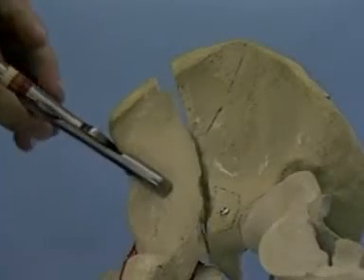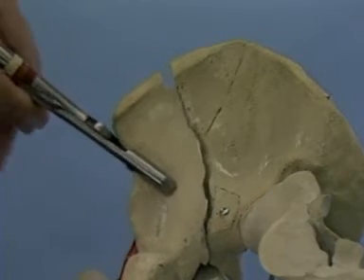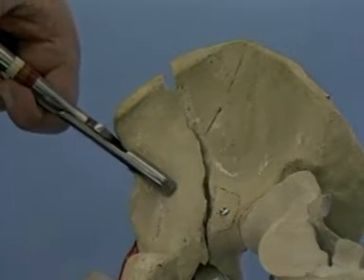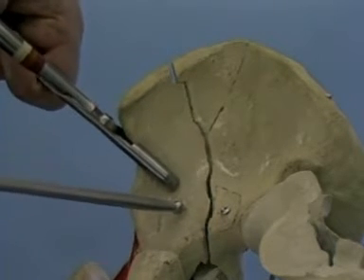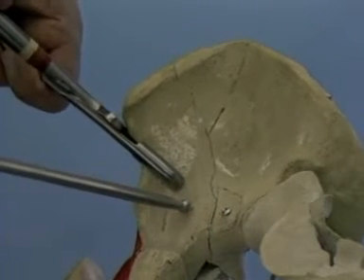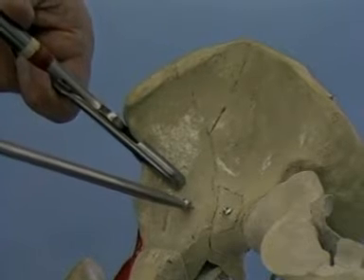A Farabeuf clamp is used to grasp the anterior border of the bone at the level of the anterior inferior iliac spine. This clamp will control the rotation of the anterior column. Pressure with the ball spike near the pelvic brim corrects the medial displacement of the anterior column.